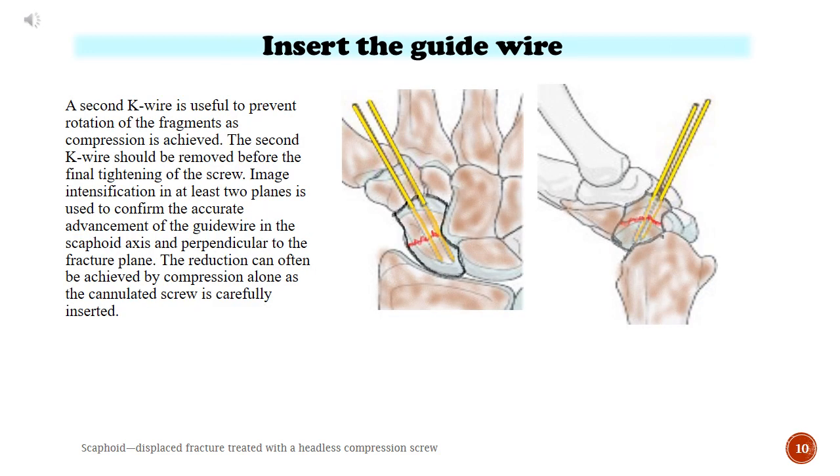A second K wire is useful to prevent rotation of the fragments as compression is achieved. The second K wire should be removed before the final tightening of the screw. Image intensification in at least two planes is used to confirm the accurate advancement of the guide wire in the scaphoid axis and perpendicular to the fracture plane.